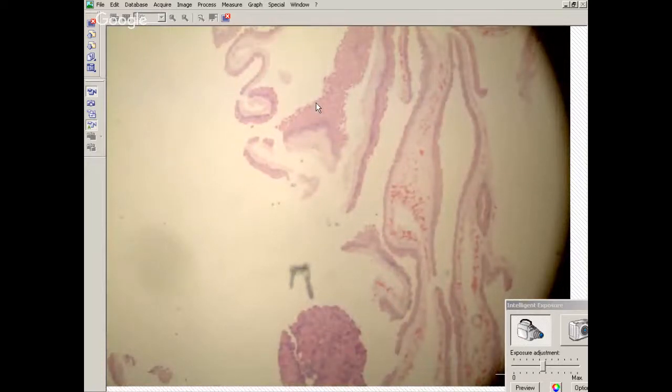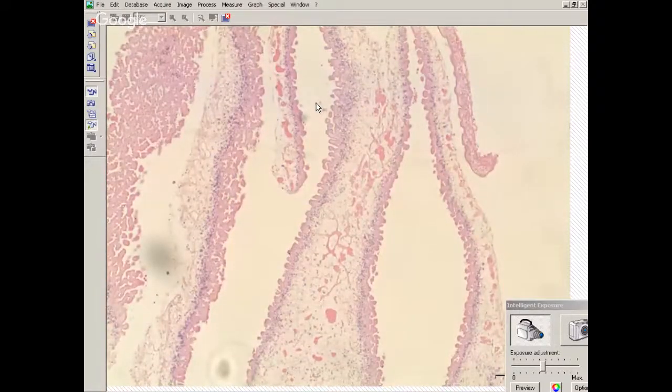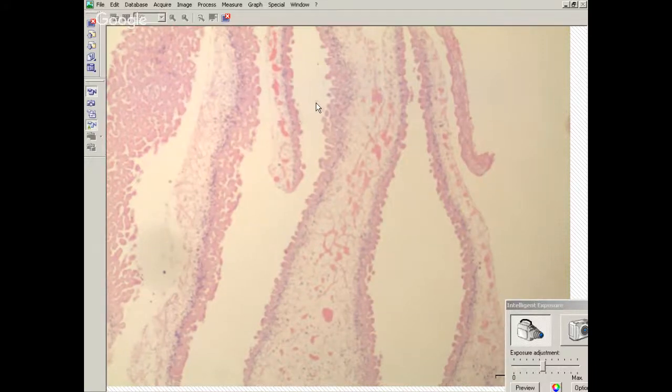Okay, so this was found in a patient that has a small cyst in the brain, and within the cyst there's a tiny little dot. The cyst has a little dot inside it. Neurocysticercosis. Yes, so this is neurocysticercosis. This is another one you need to be able to recognize. It's pathognomonic. This is the larva of cysticercosis. In cysticercosis, you have a thin-walled cyst, and inside that thin-walled cyst is the larva.